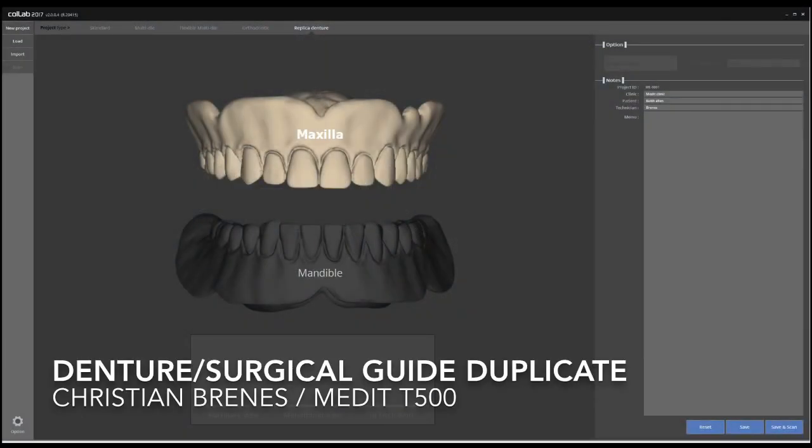Hey guys, this is a quick demonstration of how to use a T500 for a denture duplicate or surgical guide duplicate from a complete denture. The process of using this scanner is way more simple and automated than using an intraoral scanner.